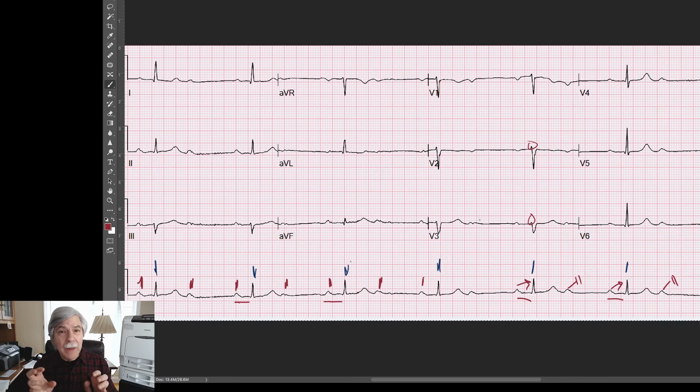For those beginners, I hope I'm not going over your head, but these clinical live streams are for people who are in the medical field, who are dealing with ECGs all the time and want to get that really keen appreciation for the nuances, the subtleties of electrocardiography.